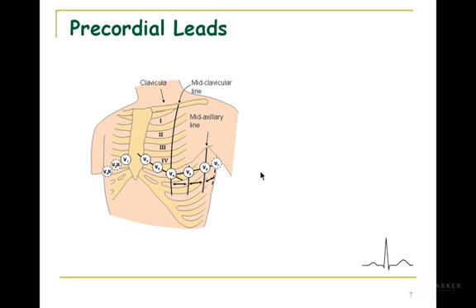But keep in mind that even though I'm going to call this a 12-lead ECG, there's only 10 monitor leads that are required. So okay, let's think about it. You've got 6 on the chest. So just think of it as wires. You've got 1 on the right wrist, 1 on the left wrist, and 1 on the left ankle. That's 9. Okay, where's 10? The 10th is a ground that's placed on the right ankle. Remember the black one in lab. There's a ground. So you have 10 wires, but you can get 12 different views of the heart.